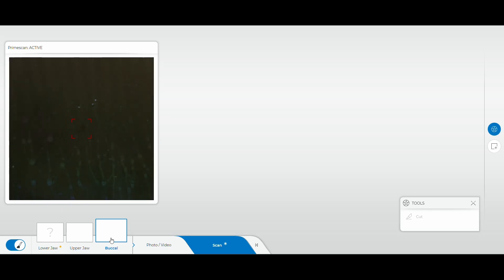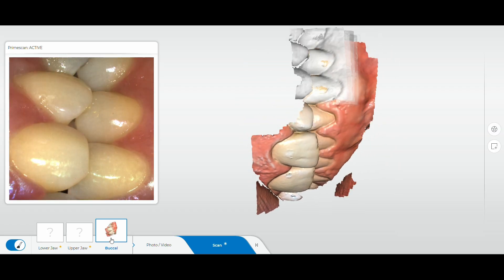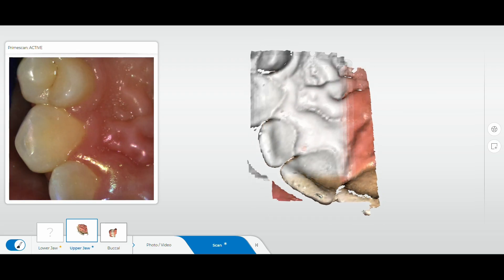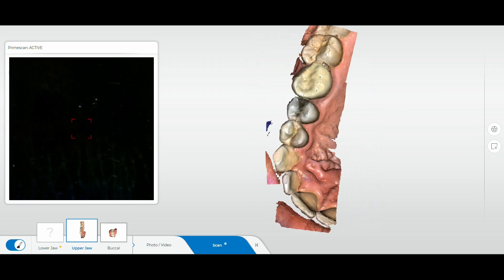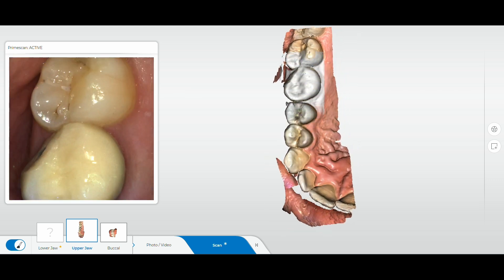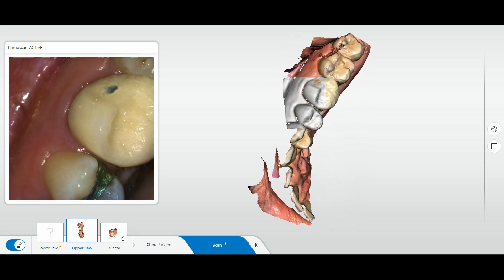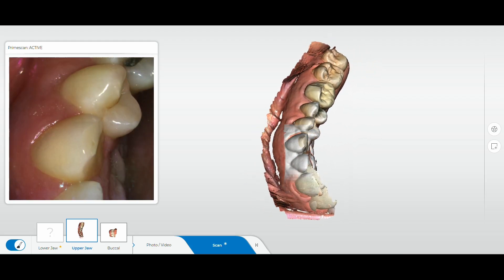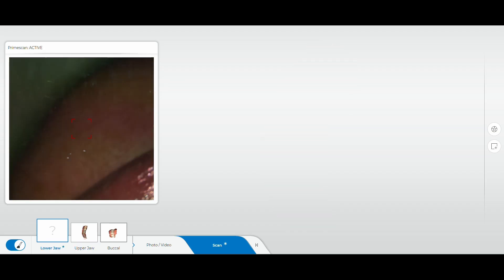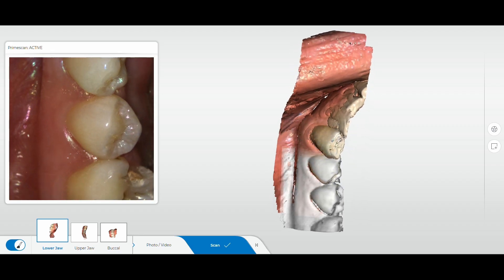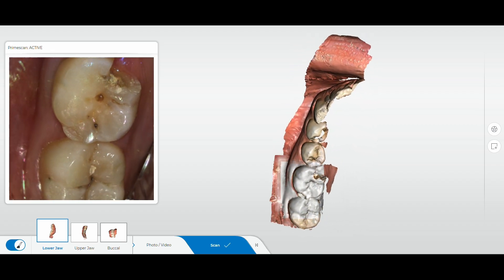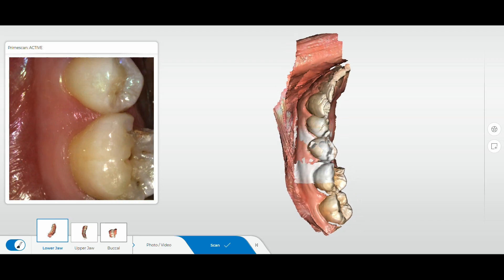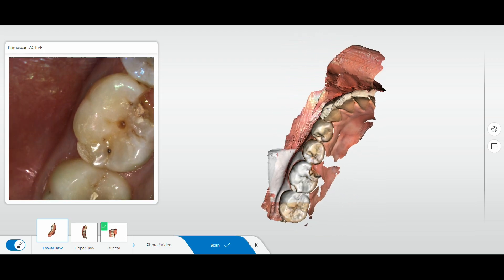With this machine, we start by doing scans. First is a buccal bite scan — how the teeth fit together. After that, we scan the opposing arch, which is the upper jaw, to capture the teeth opposing the tooth we're working on. Now I'm scanning the lower jaw with the fractured tooth. You can see the front half of that tooth is completely gone, there's decay underneath, decay on the chewing surface, and a chip on the very back side of the tooth.